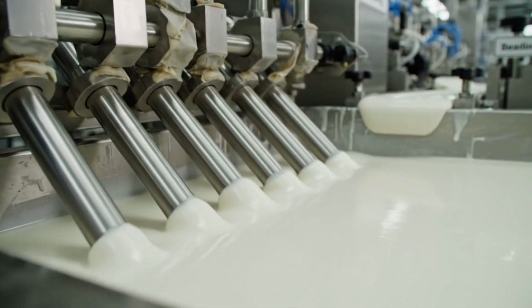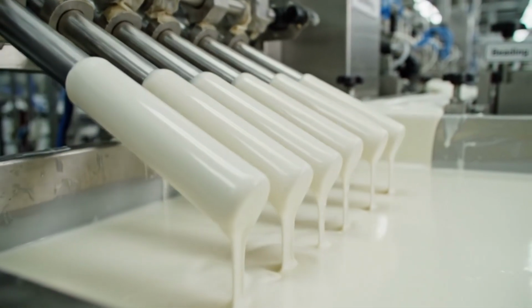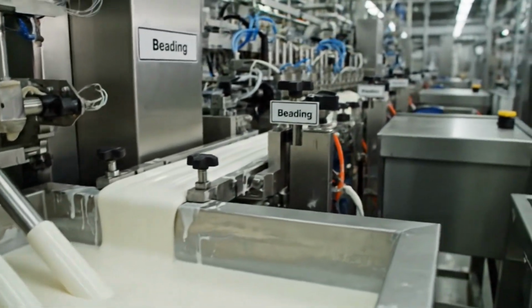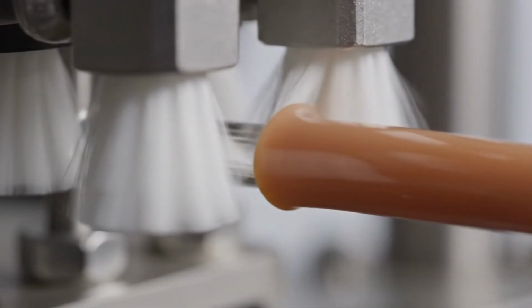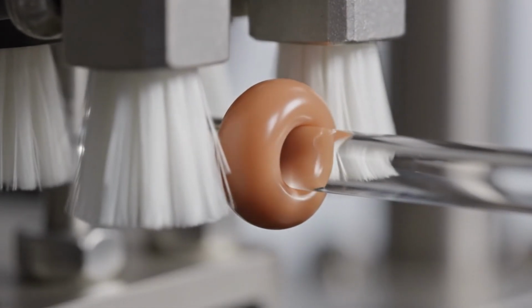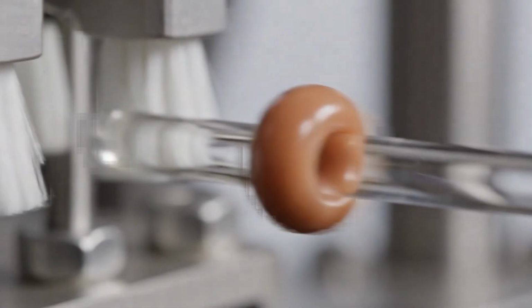A second dip is the gold standard for safety, creating a multi-layered barrier that is incredibly strong yet ultra-thin. That small ring at the base is essential. It provides strength for handling and ensures the condom stays in place.